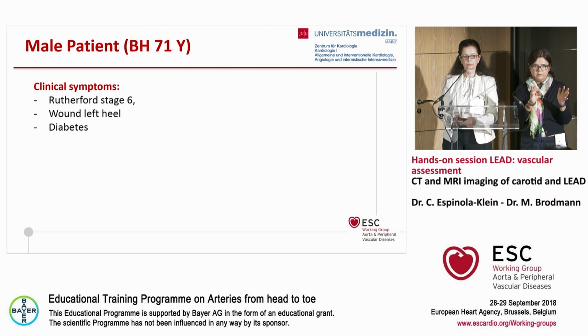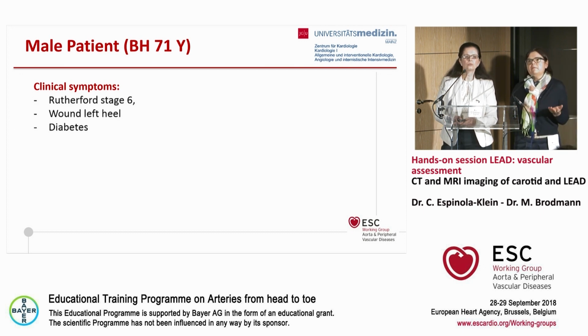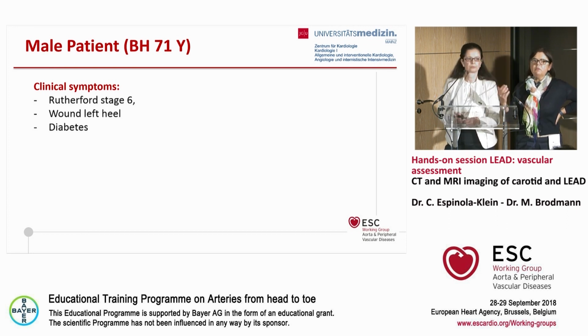I know this calcification issue. That's a topic in every discussion. At the end, this is not the relevant one. It's more relevant to see how the outflow is, because if you have bad outflow, the graft or whatever fails. You can do both if you are very, but this is not appropriate for the patient, and it's very expensive, I would say. And you can say something about the calcification also by MRI, or ultrasound, and you can look at the source images.